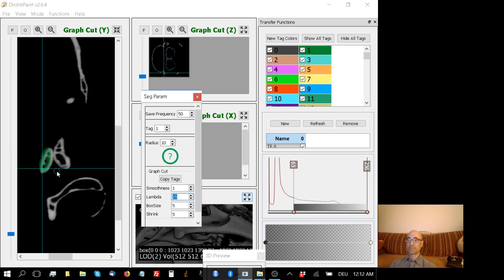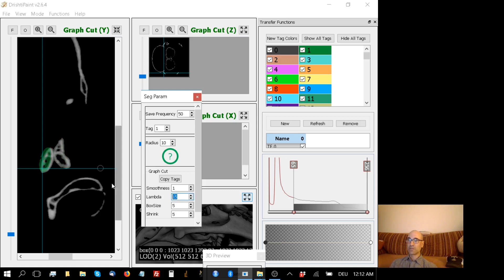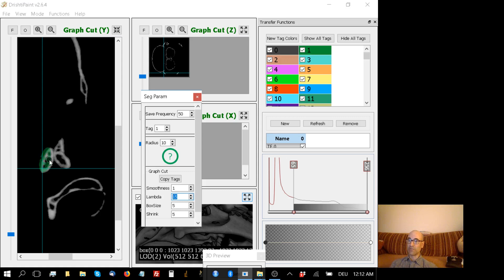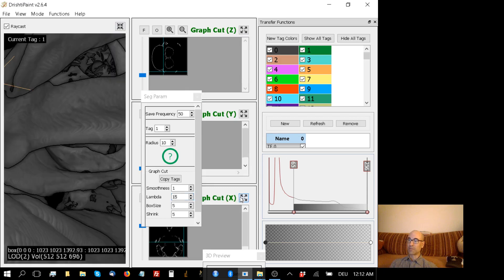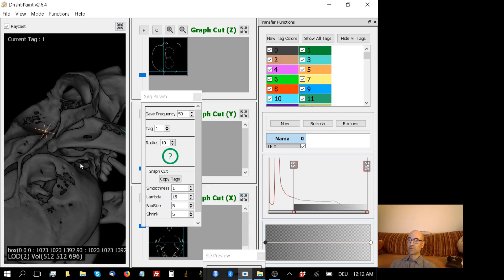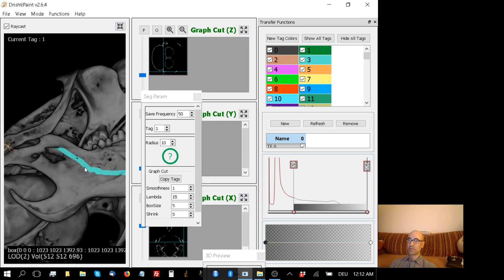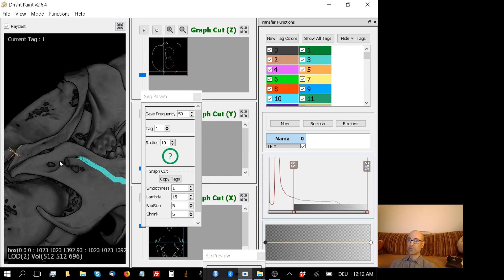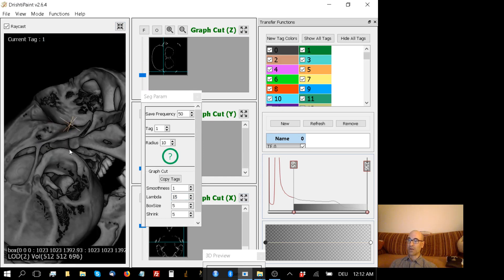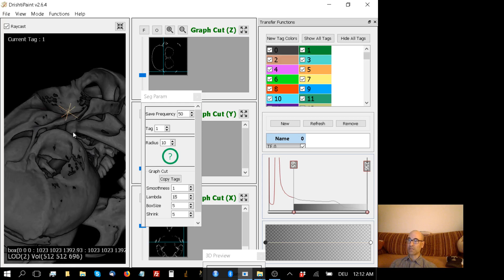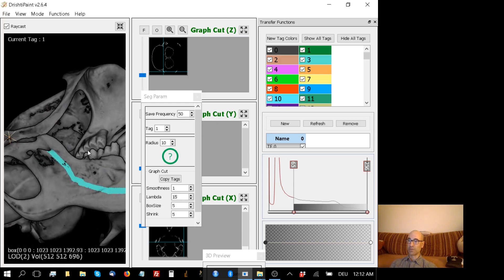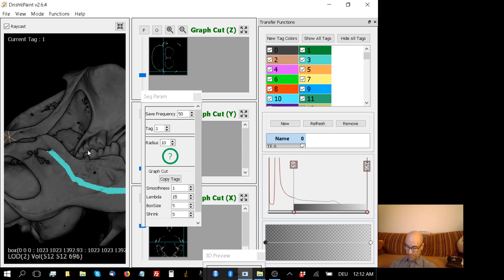Yep. Okay. T for tag with lambda 15. So I'll tell you what, I'm going to come back to the video in a moment. The whole point here is to go through this squamosal side of the jaw articulation, so that when I go back to my jaw, these tag number 3, these blue colored tags, will spread throughout the jaw but not cross that line where I'm just tagging the squamosal part. Okay. I'll be back in a minute.